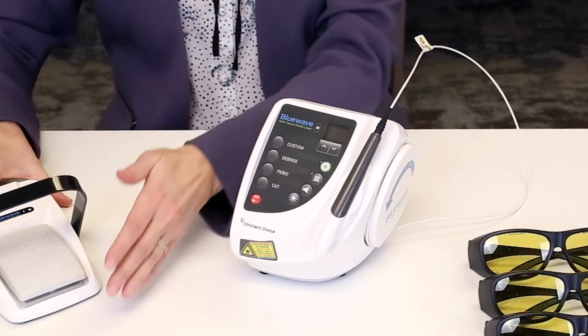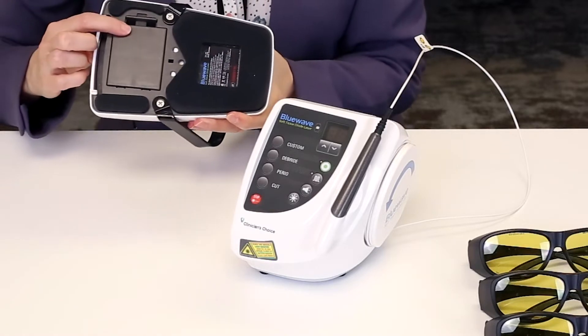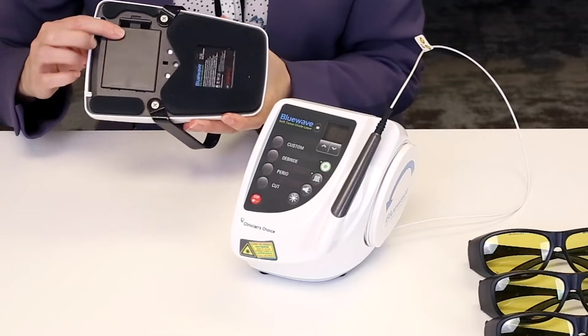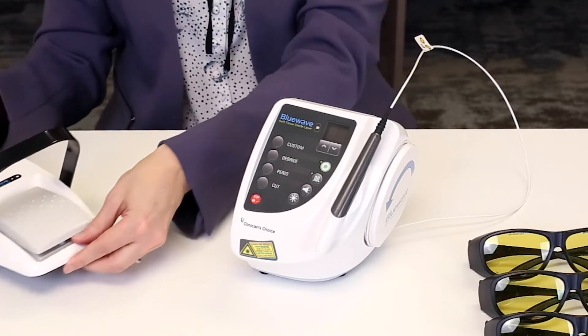The first thing you want to make sure is that you have inserted the batteries properly into the BlueWave foot pedal unit. This is a wireless foot pedal that comes pre-synced from the factory to your specific laser unit.